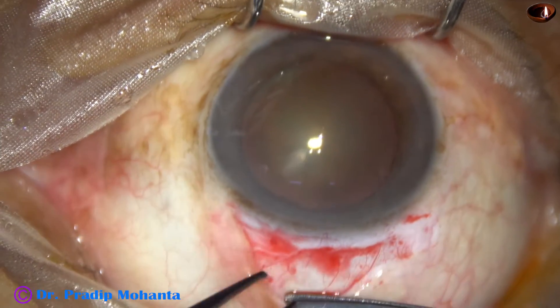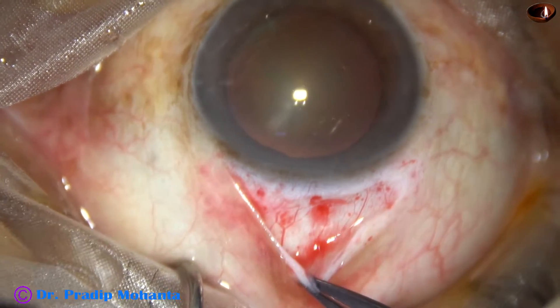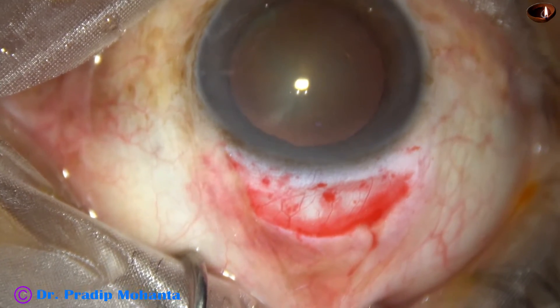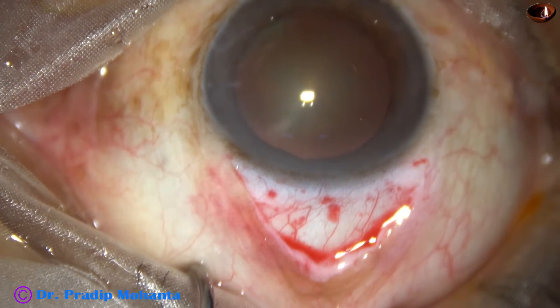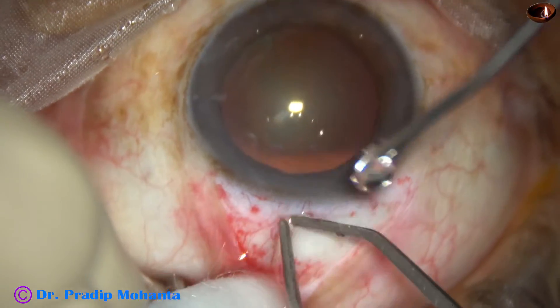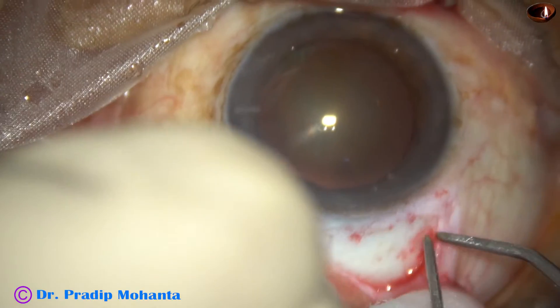We must expose the sclera if we want to do a very nice job. The sclera is exposed and then very mild cautery is done to get a bloodless field for making the sclerocorneal tunnel. This is a very mild bipolar wet-field cautery.